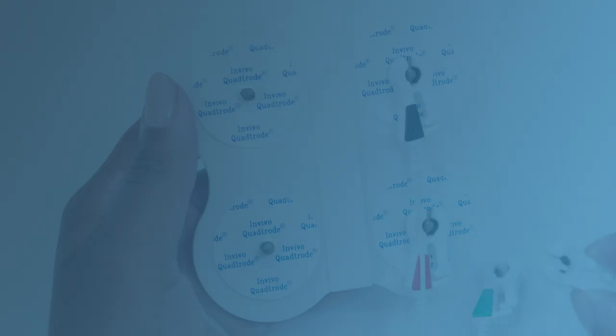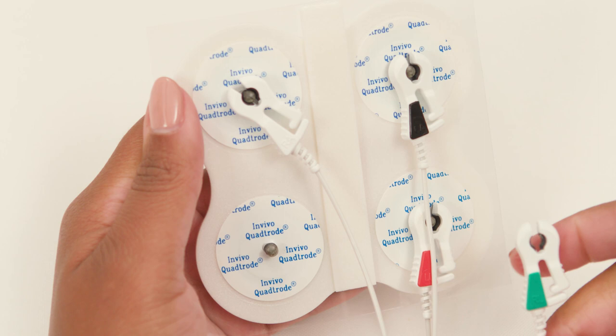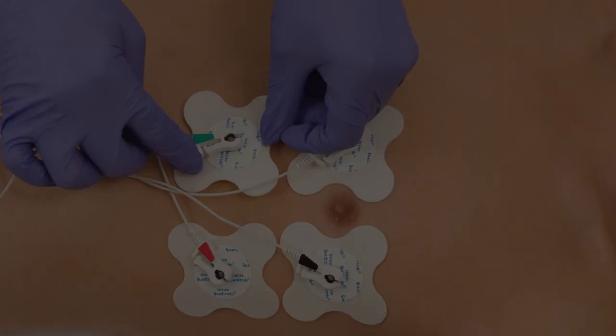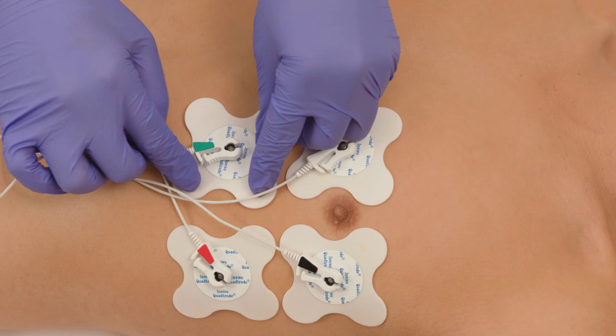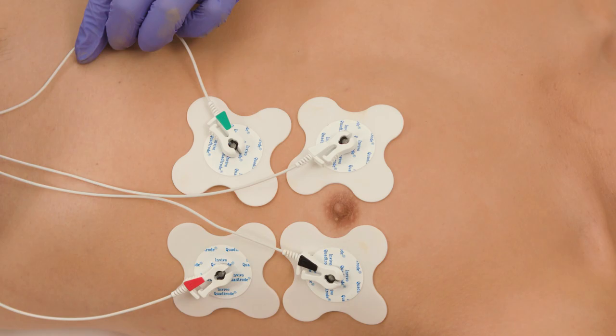When attaching the ECG lead wires to the electrode, squeeze each clip open and then place the clip onto the electrode contact and release. Be sure to attach the clips to the electrode contacts as shown on the color-coded diagram found on the ECG cable. After placing the electrodes, make sure the ECG lead wires do not cross or loop. When lead cables form a conductive loop in contact with the patient's tissue, minor to severe burning can result.